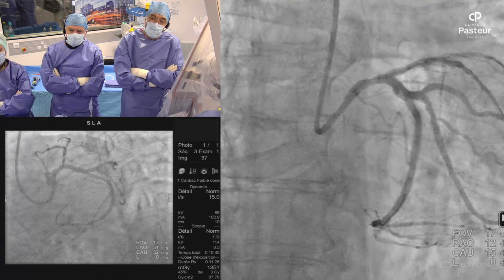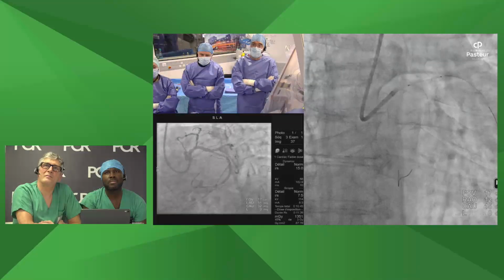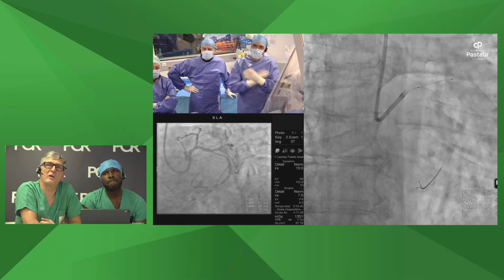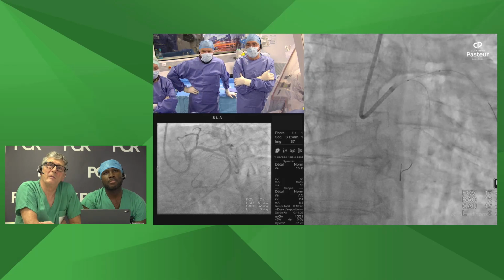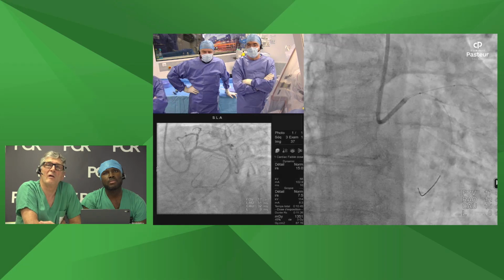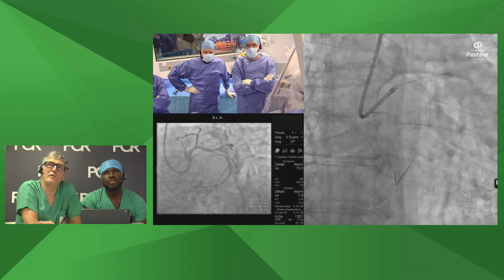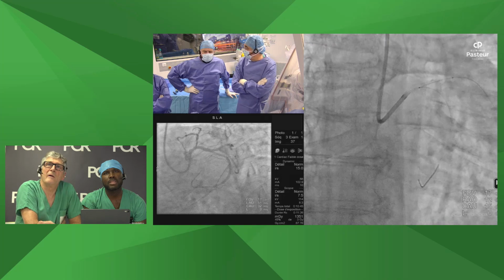In this particular case, you will start from the ostium of the left main for the stent. Yes. Because there was a lot of disease at the proximal part of the left main. Maybe you have some safe zone, the first 3 or 4 millimeters of this left main. But anyway, the big discussion is the length of the stent, so 33 or 38. What do you think?